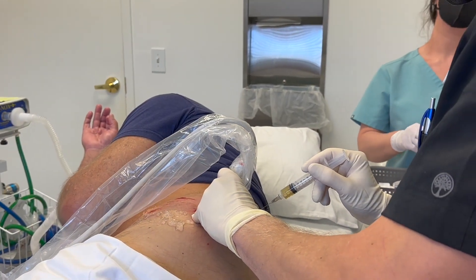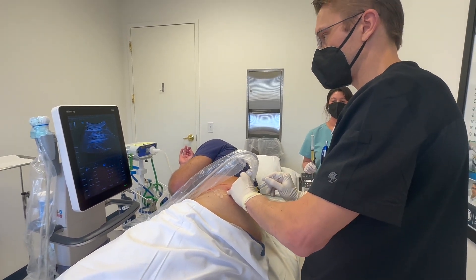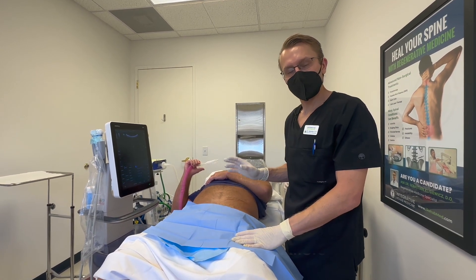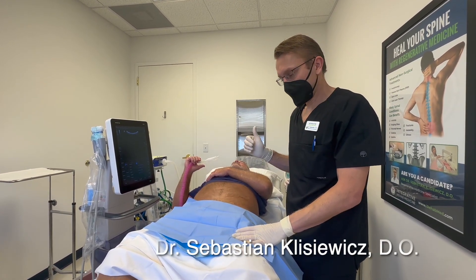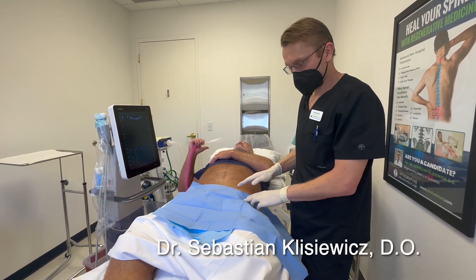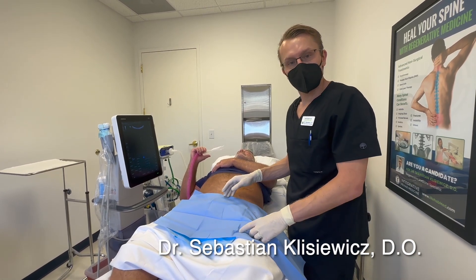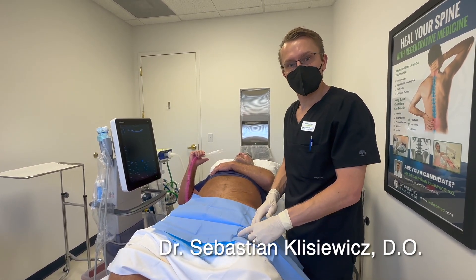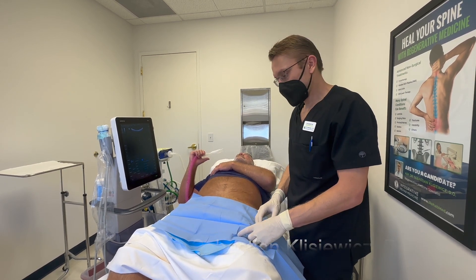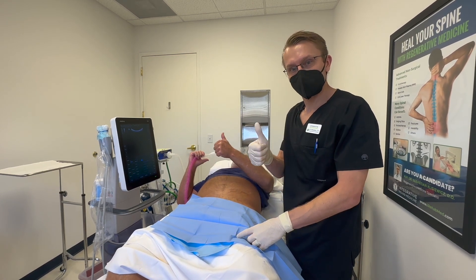Our goal is to stabilize the hip joint so it has a better chance of healing. We are done with the procedure. We took the bone marrow stem cells from his pelvis, processed them in our lab, and mixed them with some PRP. We injected it into his hip and also injected all the surrounding tendons and ligaments. Now he's going to start healing. The healing process is going to take place over the next several months, and hopefully Mark's hip is going to feel much better in a couple months when he comes back.